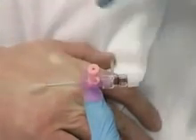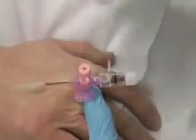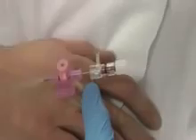Observe the first flashback of blood in the chamber of the cannula. Retain the tension of the skin. Observe the second flashback along the tube as you advance. Release the tourniquet if you do not plan to take blood.